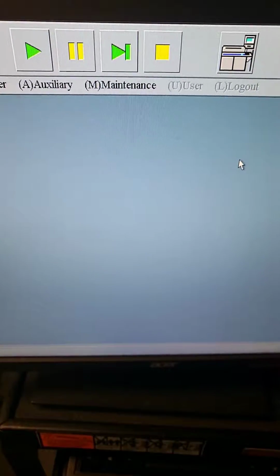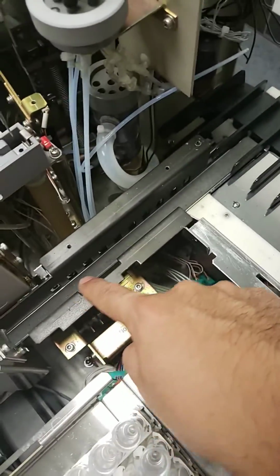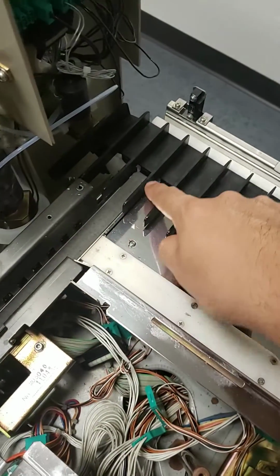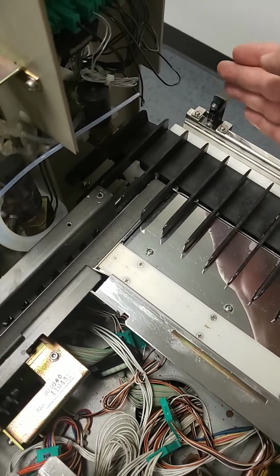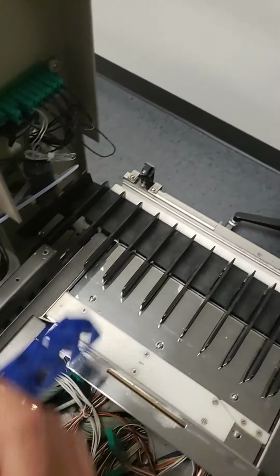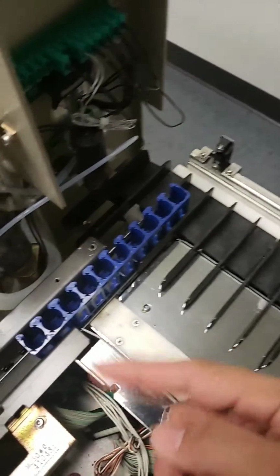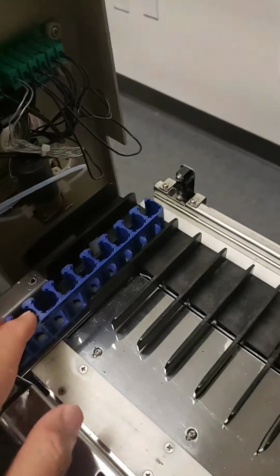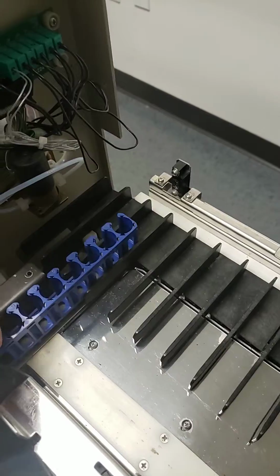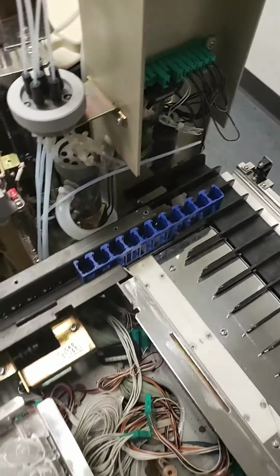All right, so let's say you're experiencing rack buffer jams, anything like that. Basically, what's happening is that transition point from being sampled right here in front of these sensors to the back alleyway right here where it hits against this S17 sensor, the rack is just not hitting its points on time. So the rack could be stalling halfway here with the belt spinning underneath it. It could be getting part of the way or just jammed up actually on the feeder right here. So there's a couple things we'll look at real quick.